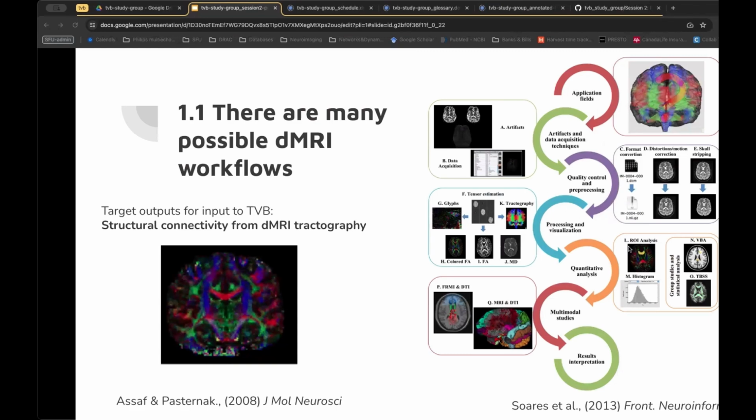And then from there is where the analysis can diverge, right? In some cases, you might know of some studies that looked at ROIs and did some ROI-based analysis. And you've also probably heard of things like fractional anisotropy and mean diffusivity, so FA or MD, and these are measures you can use to judge the integrity of white matter tracts in the brain.